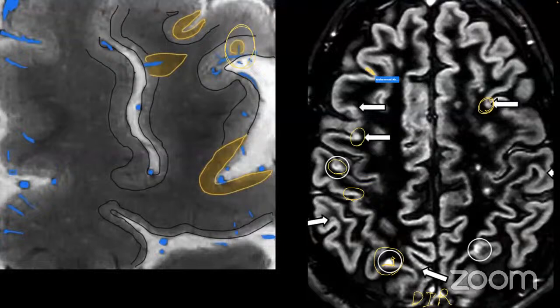So these ones are more and more specific to all the lesions we have picked up here, and are presumed to be related to subpial demyelination, but it is not a confirmation actually. It can be the other types, but usually the ones that are not dots, that are likely to spread a few millimeters through the cortical ribbon, are more specific as MS lesions on double inversion recovery.